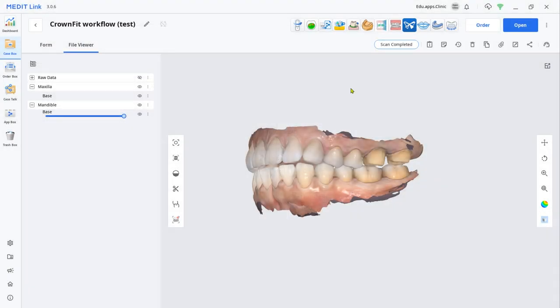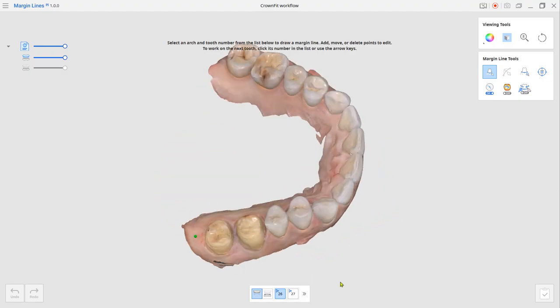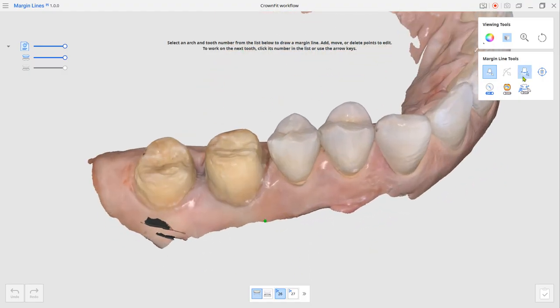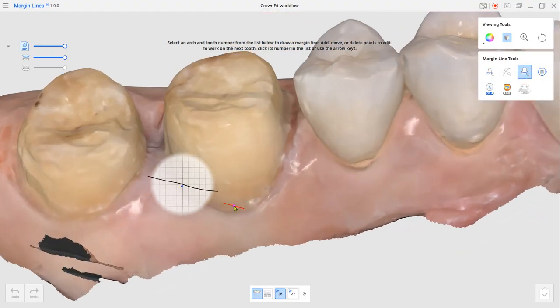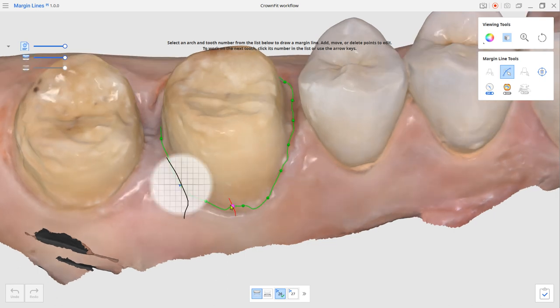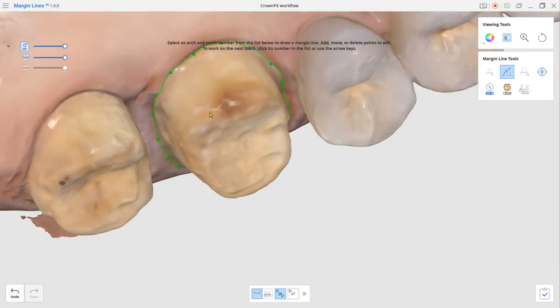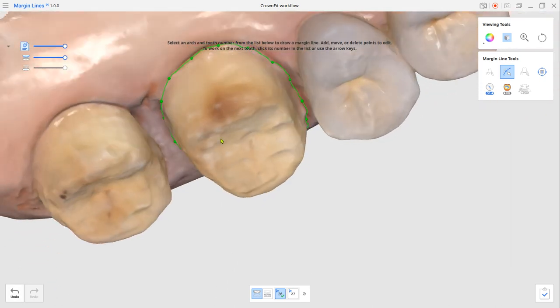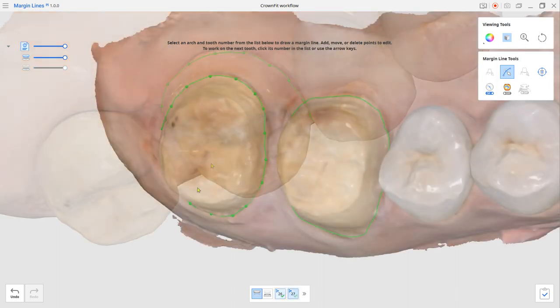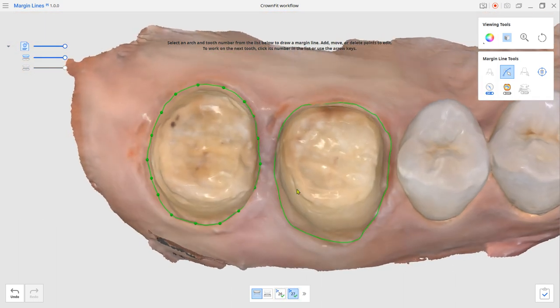After scanning, load the data from the margin lines. Choose the tooth number from the bottom and designate the margin. Now you can place an order for the prosthetic work.